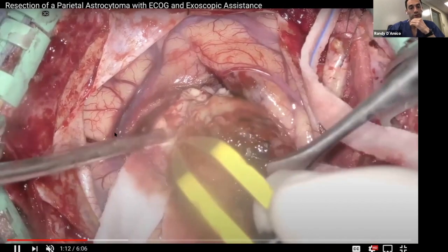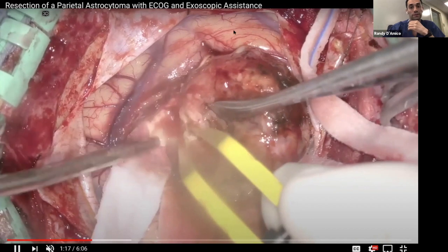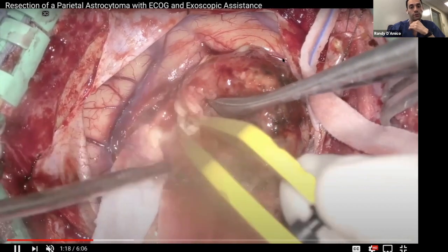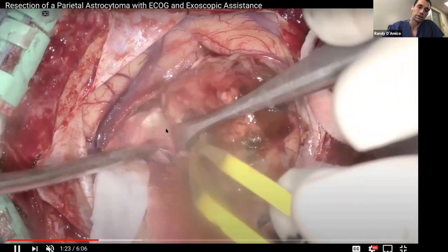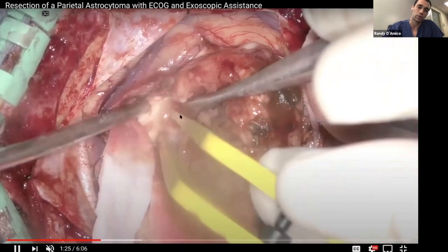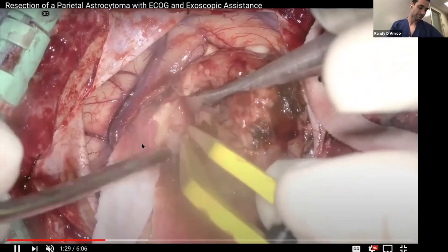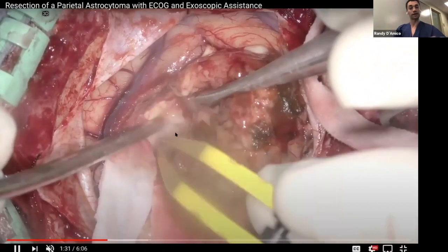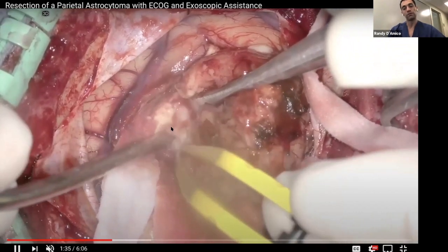And you can see there's preservation of this vein. This vein's critically important. If you take veins, you end up with strokes. If you take arteries like this one up here, you end up with strokes. So super important. Here, and I apologize, the color's a little off, but you can see there's a color difference here with the tumor. Dr. Bufar always says it looks like snot. And so it's a little bit snotty, and so you're able to suck it down, dissect the plane of the tumor there.